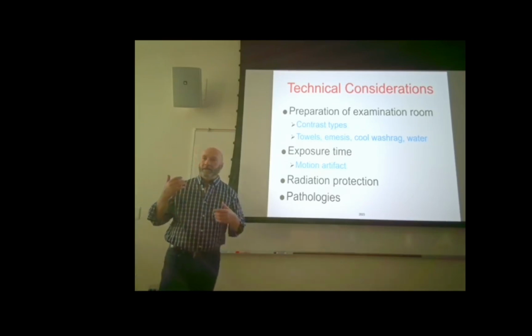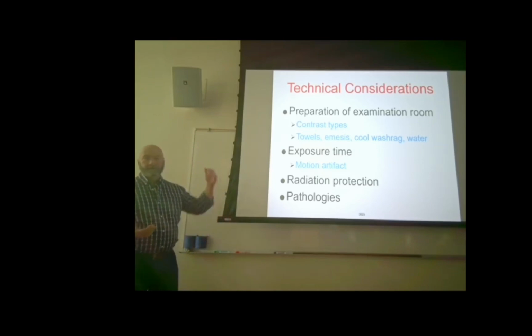So you want to take patient history, and you want to make sure that you have plenty of both of those available to you. And what you may see, different exam types, you're going to have different contrast. So if you're doing an esophagram, that GI transit's going to be very short. If that's the only thing that you're doing is an esophagram, it's going to be very short.